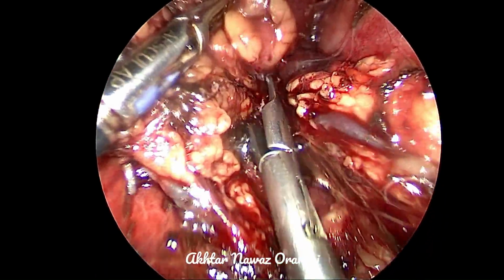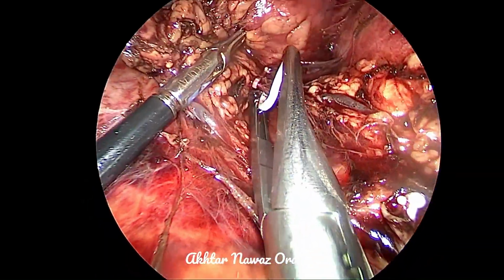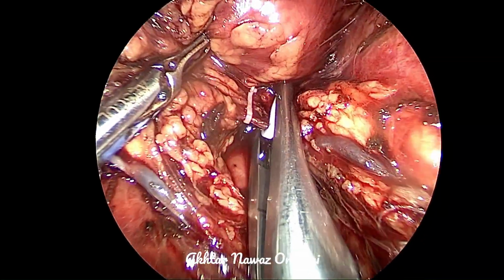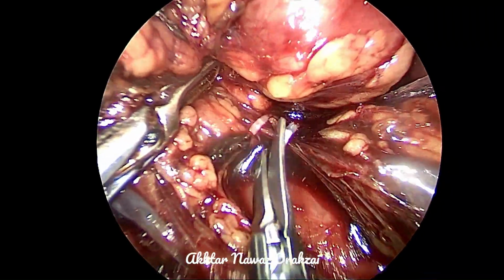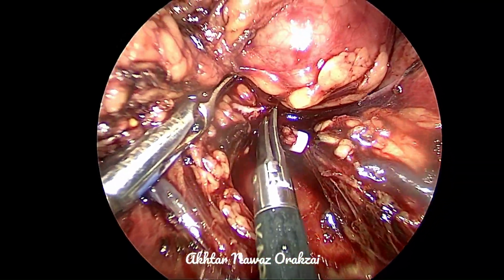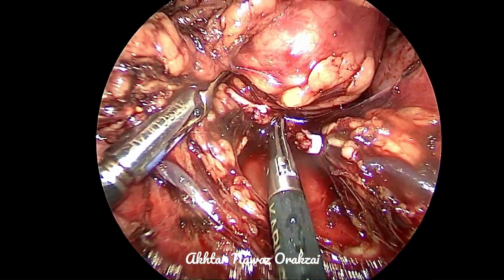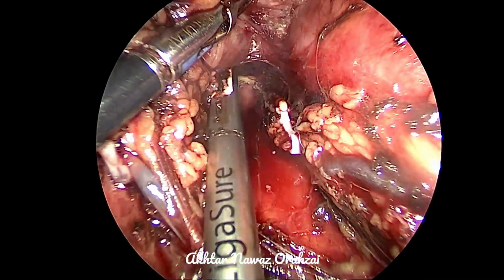So we just clip it and then cut in between, and also taking care not to injure the branch to the upper pole. This will also give us a little more confidence, so the adrenal gland will be more mobilized.